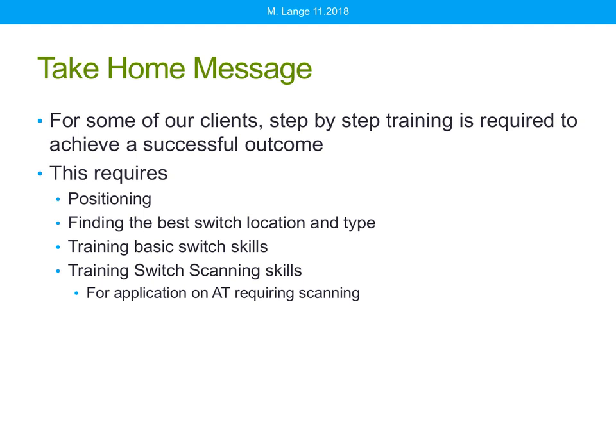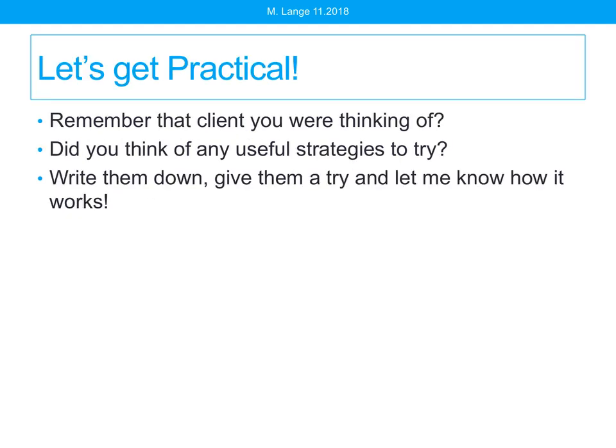But some of our clients really benefit from specific training to work on their switch scanning skills for application on any assistive technology requiring scanning. I know we focus somewhat on communication today because that's a very common application, but the same would go for other scanning applications as well.